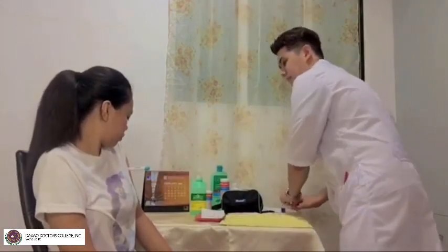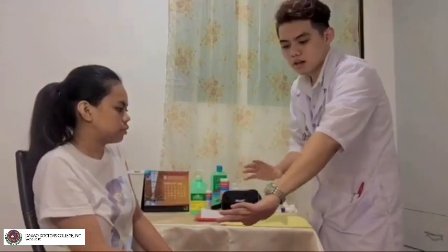Wait lang. Okay. So, we need to wait for the appropriate amounts of time after the placement. And then electronic thermometers will indicate that the reading is complete through a light or a tone. And this is to conserve time and energy while waiting. The nurse can actually assess the other vital signs. So, while waiting for this thermometer to have this sound for the reading, I can actually do the pulse assessment.